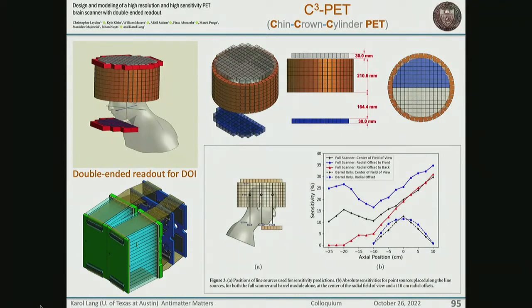So this is all simulations. We published it; it took us some time, but here it shows you the efficiency of adding these 2 flat panels, up and down, compared to the efficiency of just the cylinder. There are standards for characterizing instruments of that sort, and we are using the recommended ones, the so-called NEMA standards, for measuring and understanding the response.